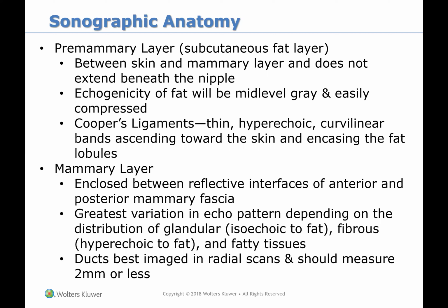The pre-mammary layer, the subcutaneous fat layer, is between the skin and the mammary layer and does not extend beneath the nipple. Its echogenicity of fat will be mid-level and gray and easily compressed. And there's Cooper's ligaments there.